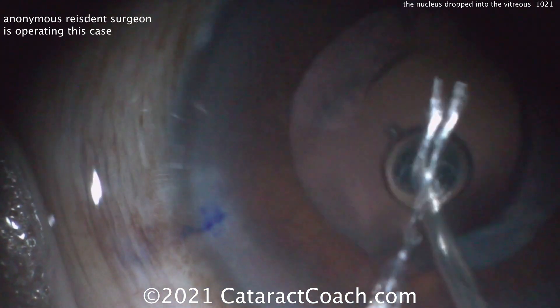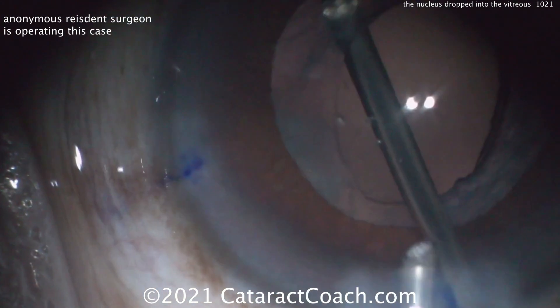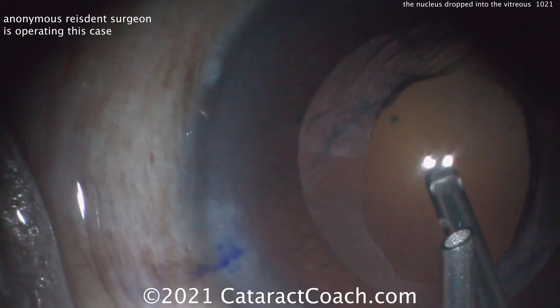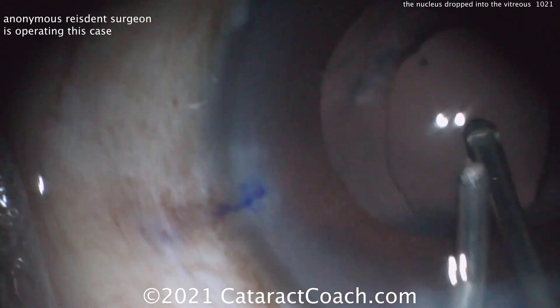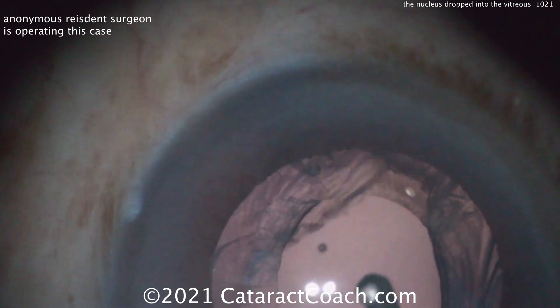Let's clean up the vitreous that's prolapsed. Using this bimanual set, you're better off using the side port incisions or making an extra side port incision. Avoid that main Faco incision because it's too big and it leaks, and you're losing the benefits of having a bimanual approach.